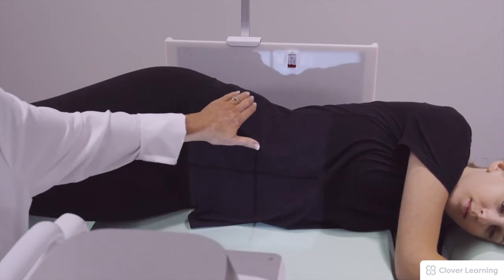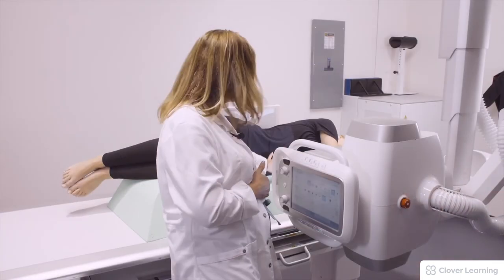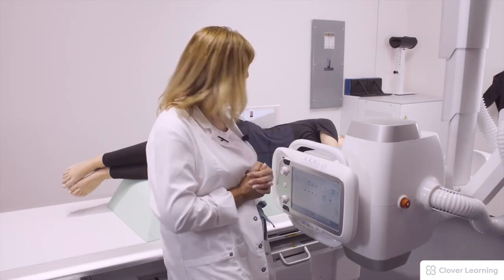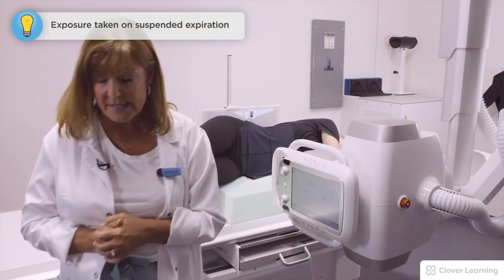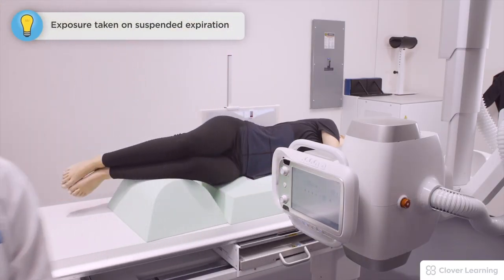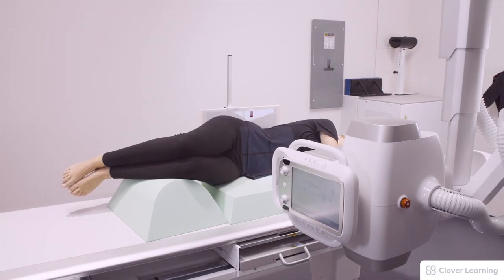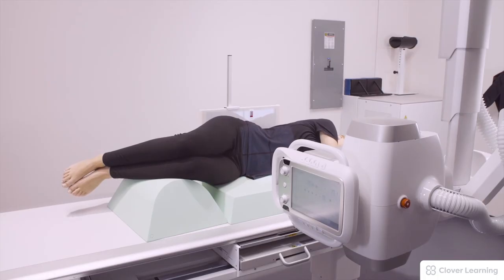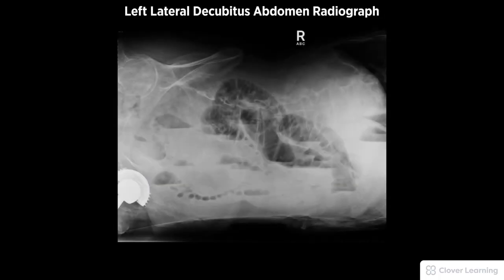We have used the central ray at the mid-sagittal plane and two inches above the iliac crest. This will be taken on exhalation. Patient, please take in a big deep breath, blow your breath all the way out, stop breathing — hold your breath — and the exposure is taken.